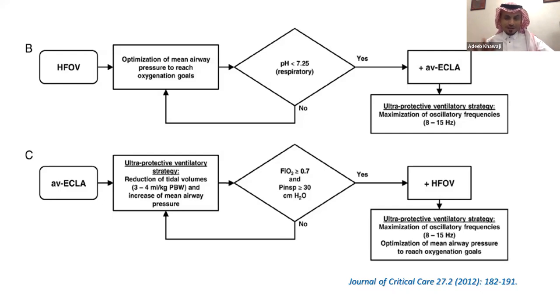I'm going to review a lot of things to see what the criteria are to put a patient on high frequency. My belief is, whatever you need to rest your lung, just do it rather than high frequency. But I find this result interesting, though the number of samples they used is very small. We'll put it forward for the sake of discussion and open-mindedness, that high frequency is an available tool in our ICUs and it has been ignored in the storeroom. We should bring it to the bedside and use it before we get to the complications of ECMO.